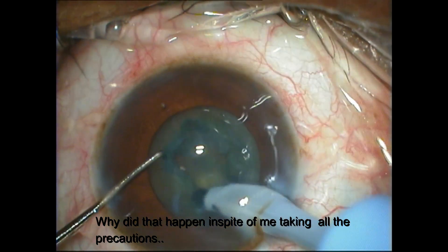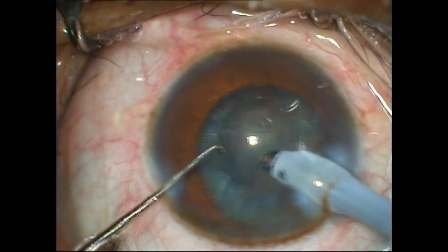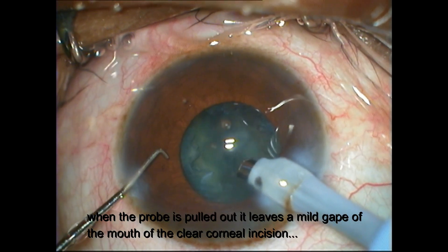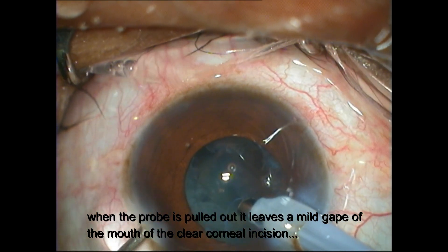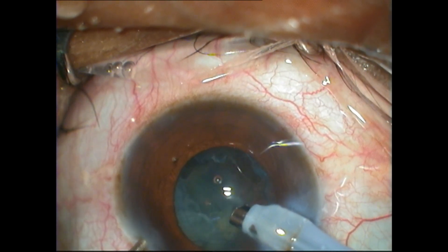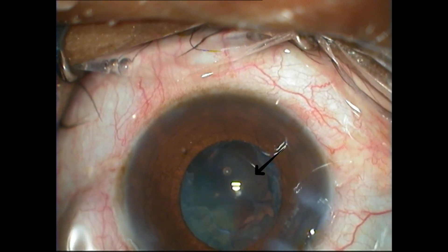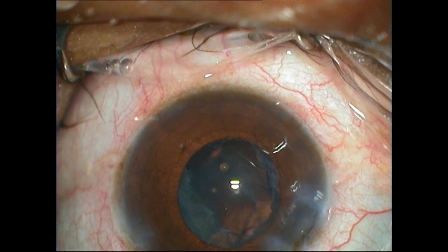Why did this happen in spite of taking all precautions? When the phaco probe is pulled out of the eye, it leaves a mild gap at the mouth of the clear corneal incision, and this causes an extrusion of the intraocular contents. You can see clearly that when I pull the phaco probe out, there is a disturbance in the internal milieu of the eye.